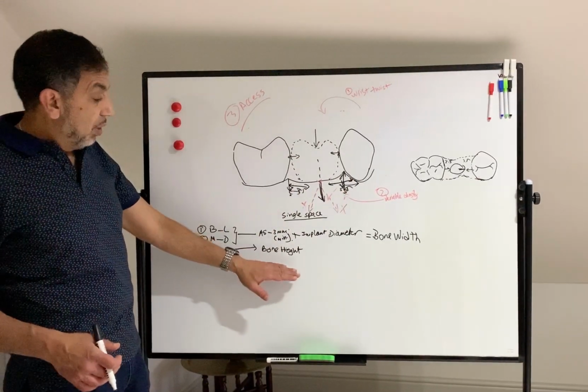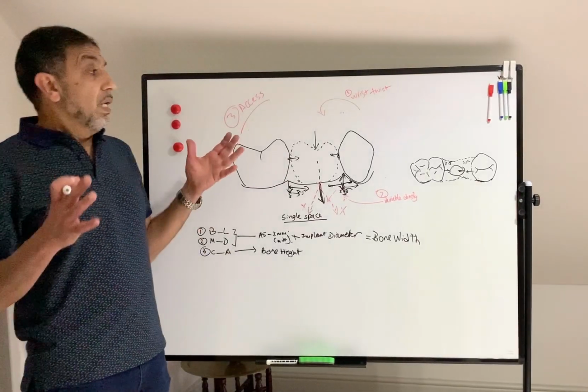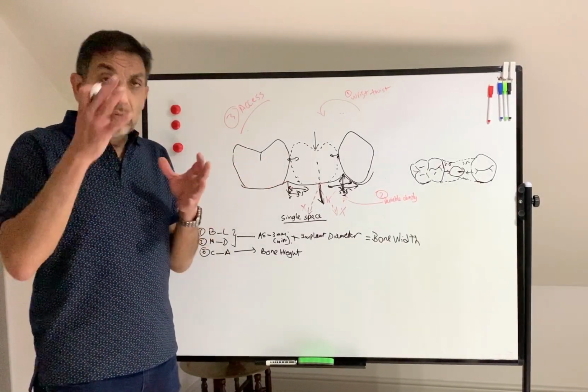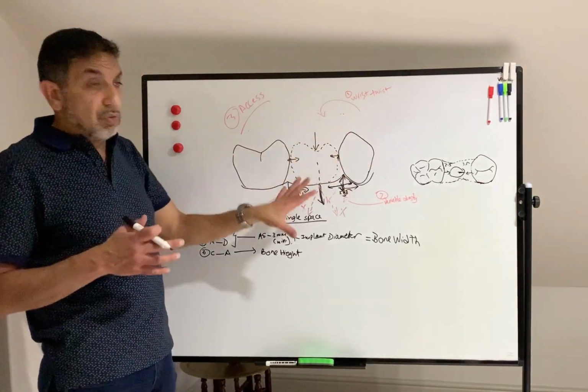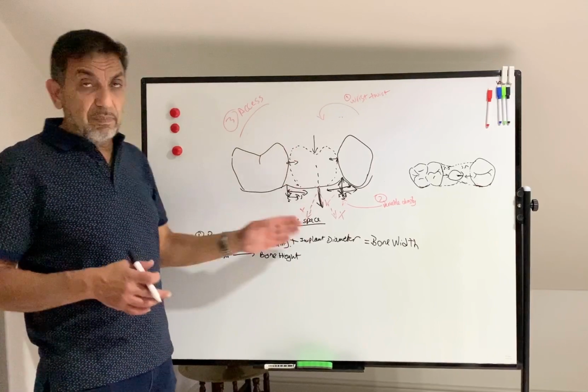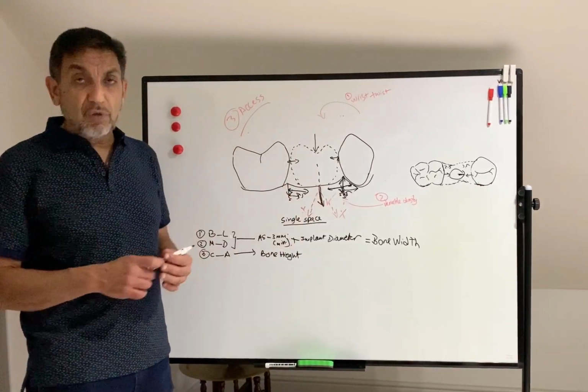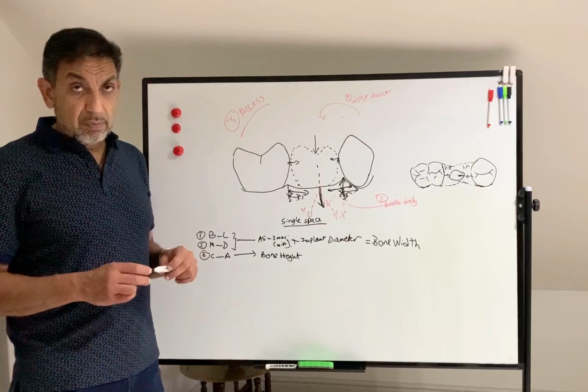Coronoapically, you've measured the bone height, okay? And that's it. So if you look at these rules and maintain these rules and protocols as you're placing a single implant in a bounded space, you will avoid positional problems.